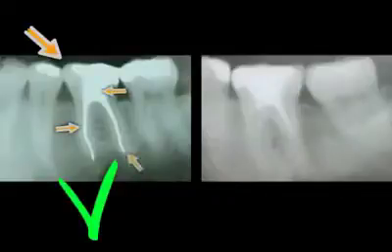On the left, you see an X-ray of a tooth with a good root canal treatment. The interior of the tooth has been homogeneously and tightly filled right down to the root end. On the X-ray, it's the light strip within the interior of the tooth. Such a tooth is able to provide valuable service for an entire lifetime.